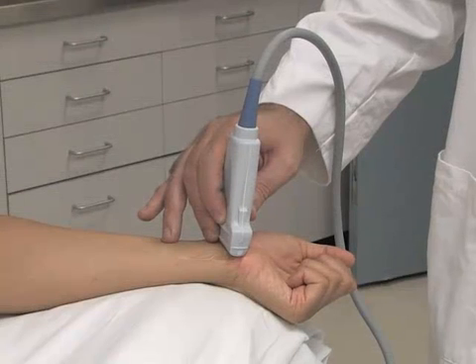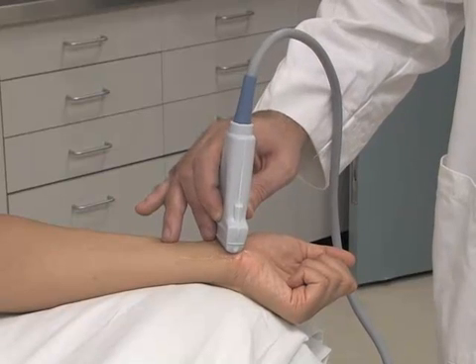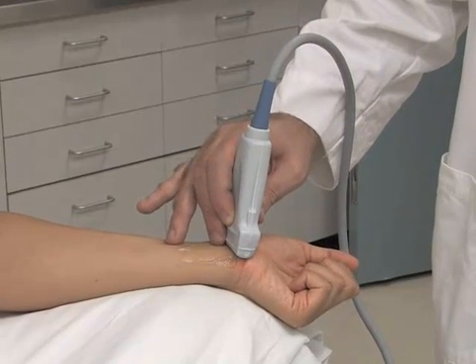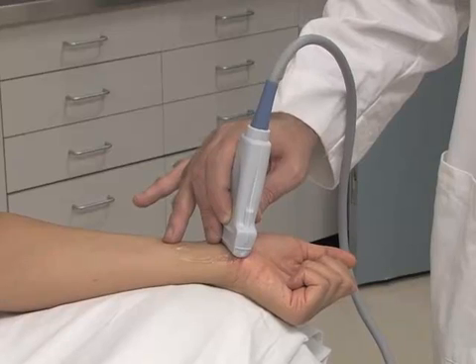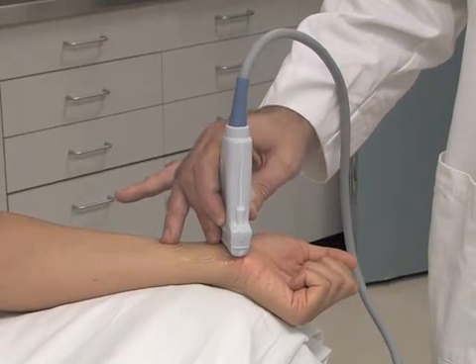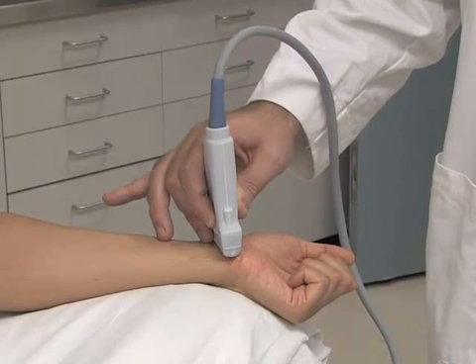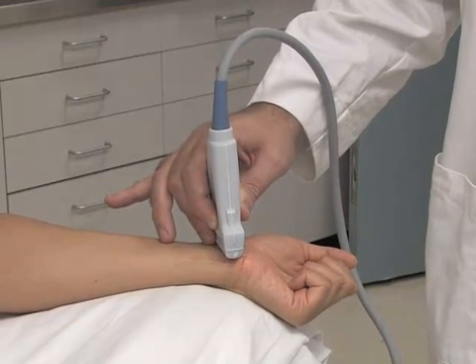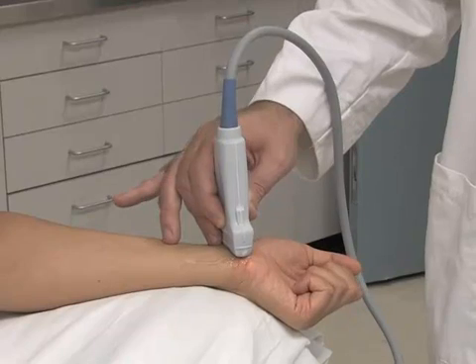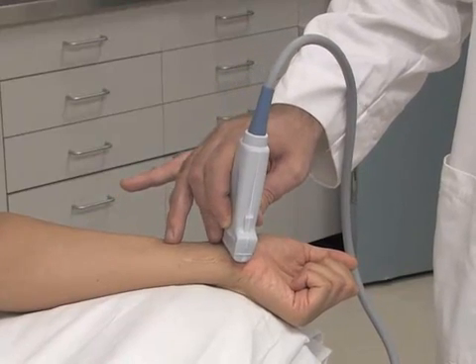The patient should be in the seated or supine position with the affected hand resting in supination. Using a high-frequency linear ultrasound transducer, begin the evaluation by placing the probe in the transverse plane over the volar surface of the wrist. The carpal tunnel will be found just distal to the wrist crease and extends from the level of the pisiform to the trapezium.